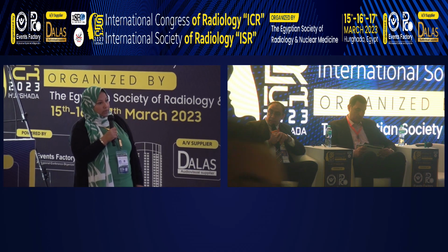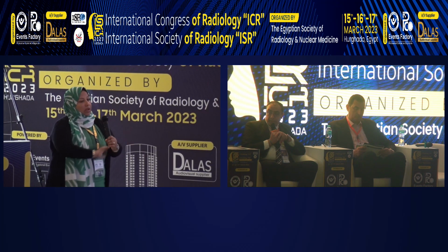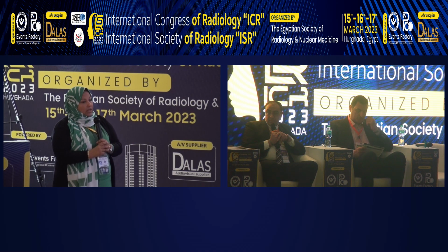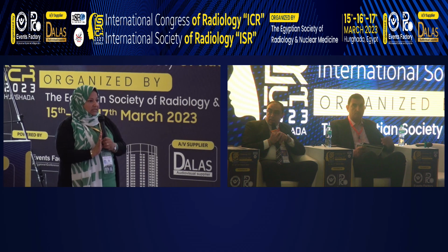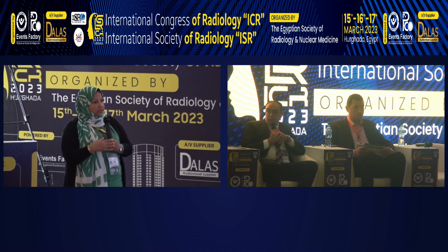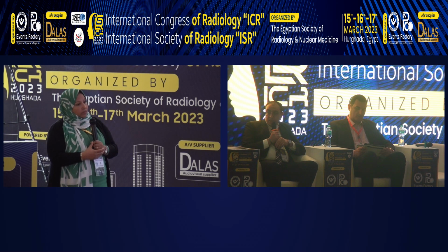Okay, what about MR arthrogram? Is there a role in chondral injury? For chondral injury? Yes. Maybe beneficial in some subtle chondral injury. MR arthrogram is beneficial, or CT arthrogram.